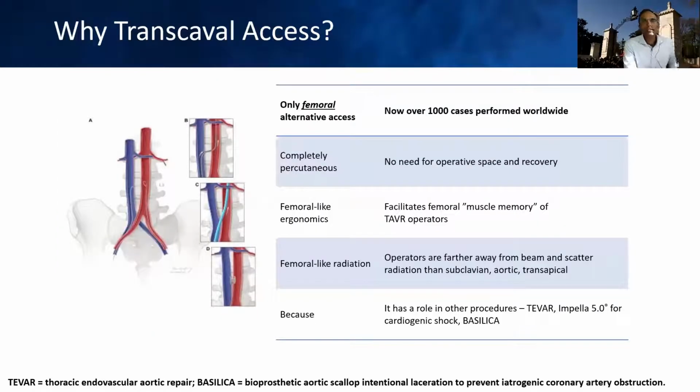So why even consider transcaval? Well, as Dr. McCabe went through, there are a number of alternative access approaches that can be pursued now that have evolved beyond transaortic and transapical that are approaching these in more of a percutaneous approach.